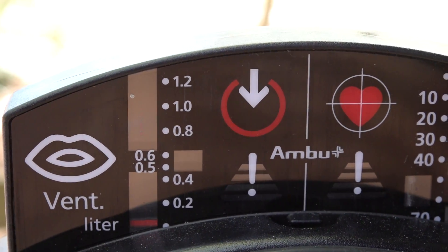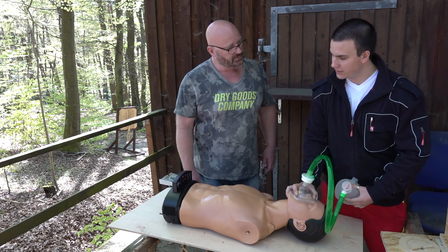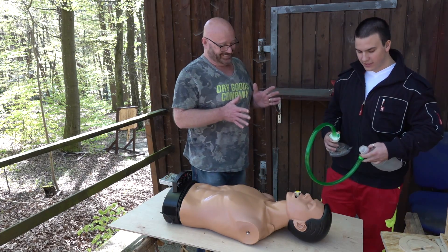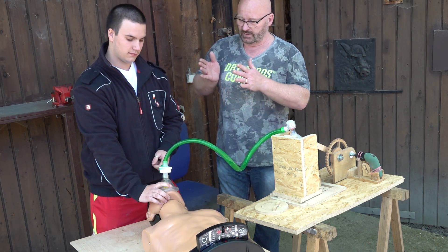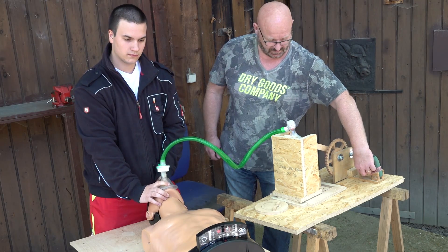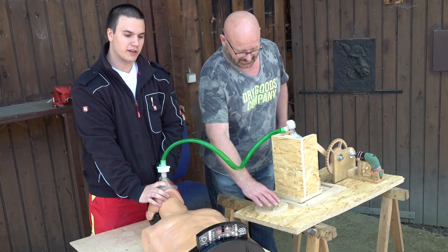You can see the level here, and it must be in this green window — between 500 and 600 milliliters. So that's how it's normally done, and this is what we're going to simulate. The position is standing behind the patient, pressing the mask on his face. Now we begin to pump. As we can see, it's not sufficient, but it already works.